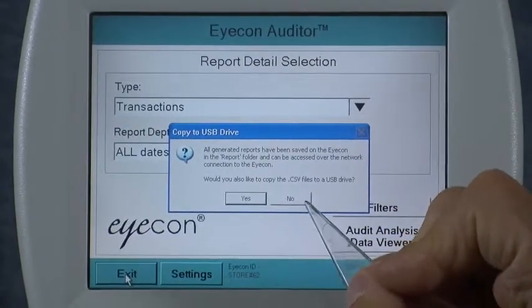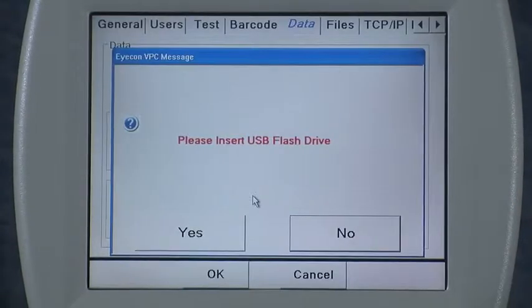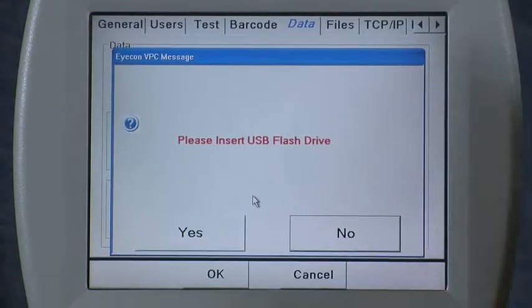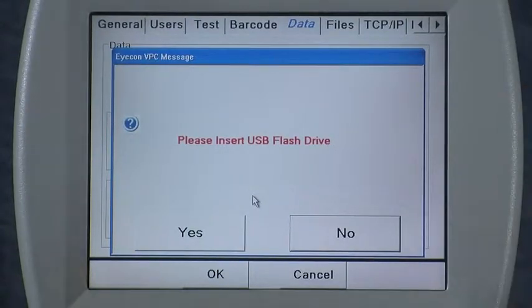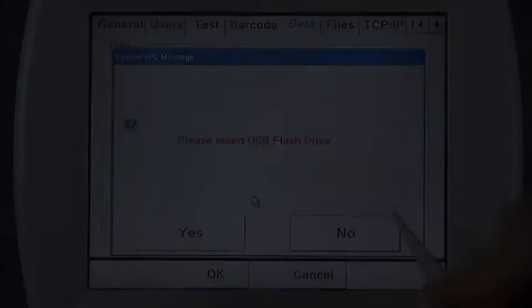I'm going to say yes, I would like to copy them to the USB stick. It then pops up a message prompting you to insert your stick, which also verifies that you have enough room on the stick for the reports you've generated.